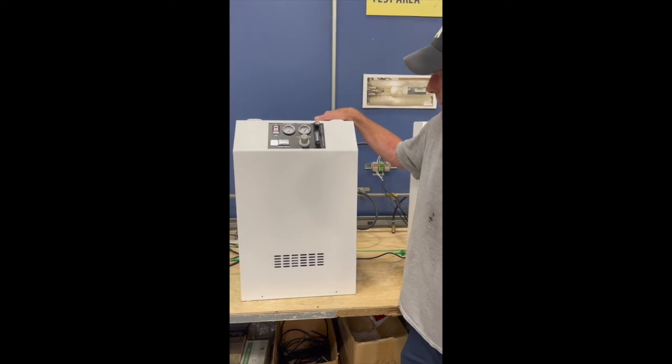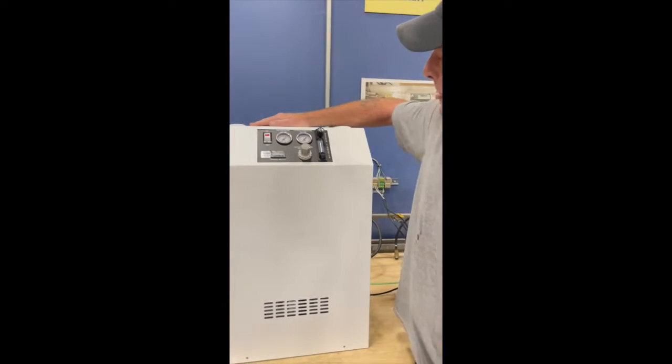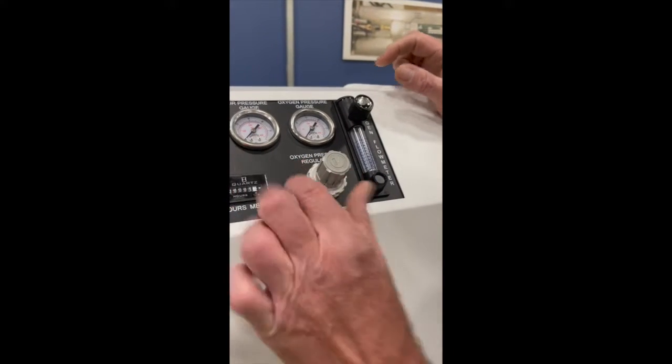We have an OG15 and an OG20 here. This is our OG15 which will do 15 psi, 12 psi at 15 SCFH. This is a regulator — an oxygen pressure regulator.